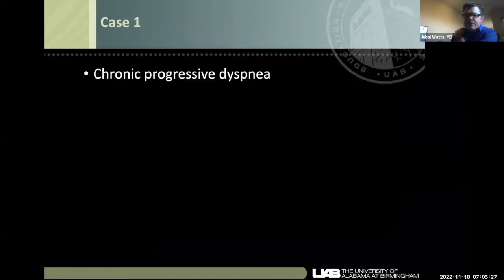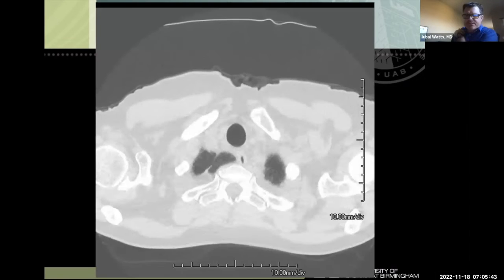So I typically do these as case presentations, and we'll show the images first and then talk about them, to give people time to look and assess and see what they think is going on. So this is case number 1.